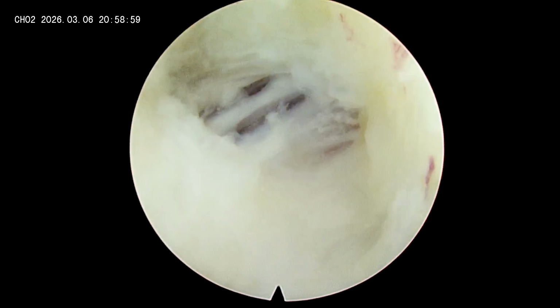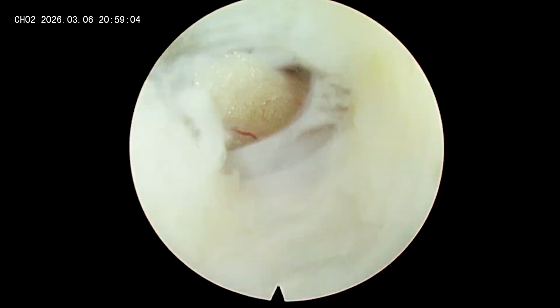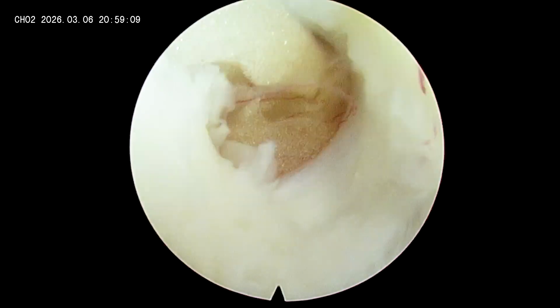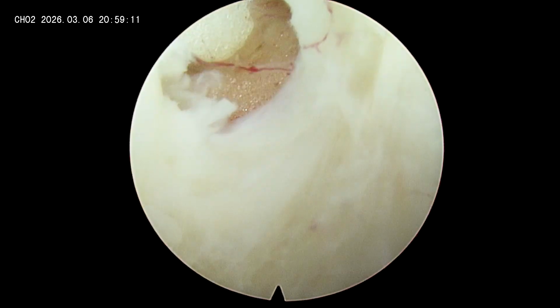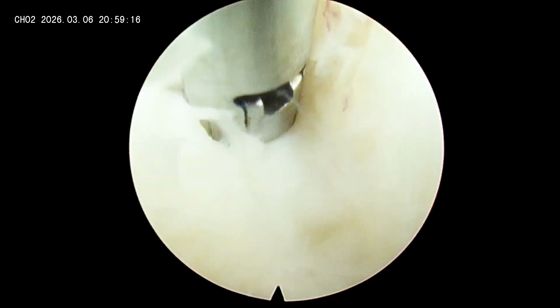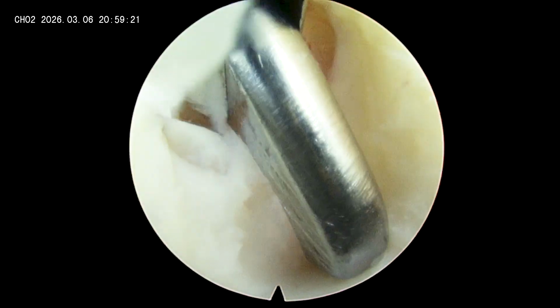So the moment you insert inside the epidural space, always change the direction of the annular cutter. So previously the sharp tip of the annular cutter was lying medially. Now here, once I entered inside the epidural space, the sharp cutting edge is lying laterally. So in short, I am cutting the ligamentum flavum from medial to lateral aspect.